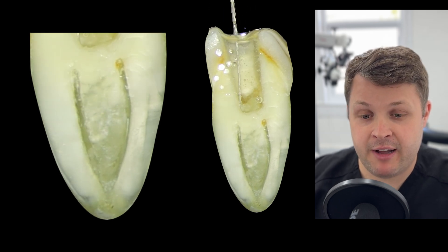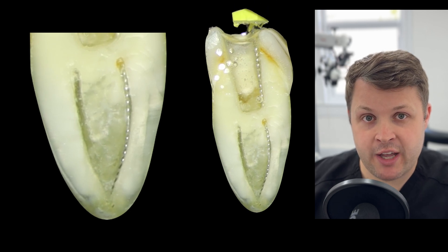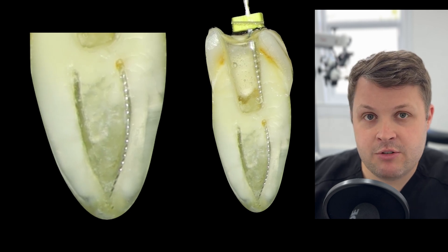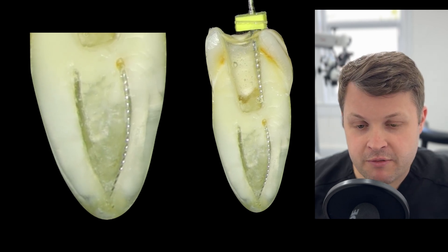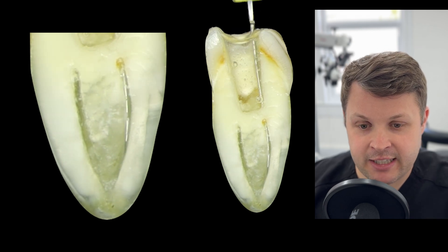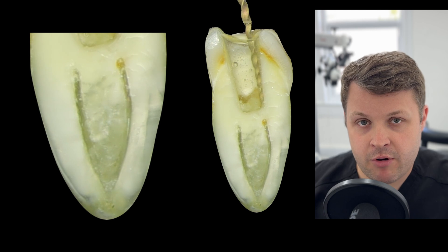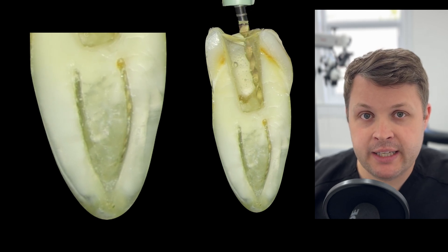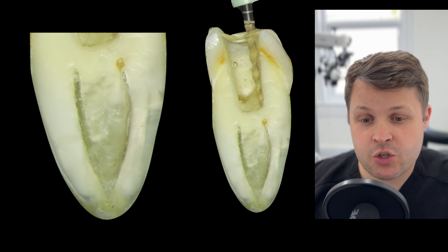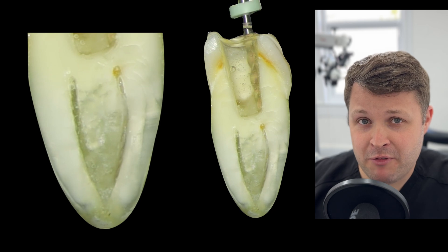Another important thing is to recapitulate: get a hand file back in the same canal and make sure it's still open. Rotary files can create debris, so always get back in with a hand file and give it a clean out. Once I feel I've got the glide path file to zero and the lingual canal is shaped adequately, I'm ready for a higher diameter file — in this case a size 20 high flex.